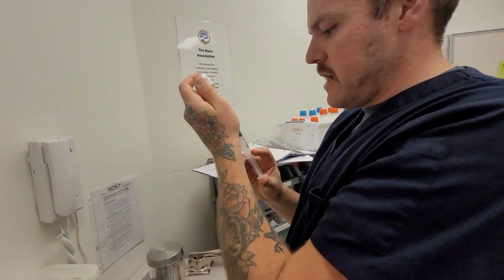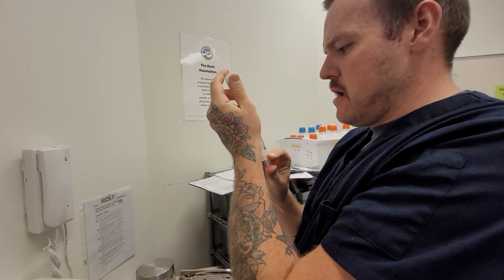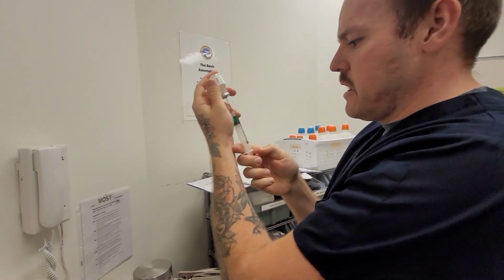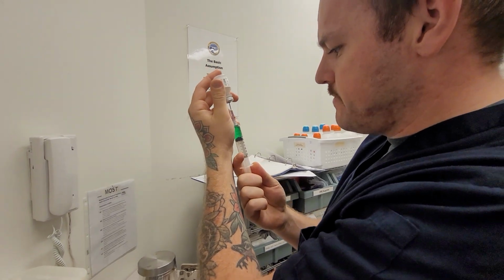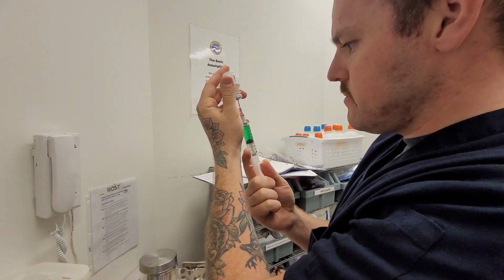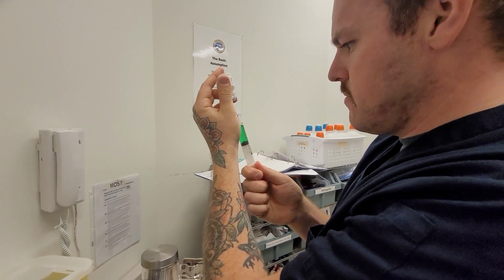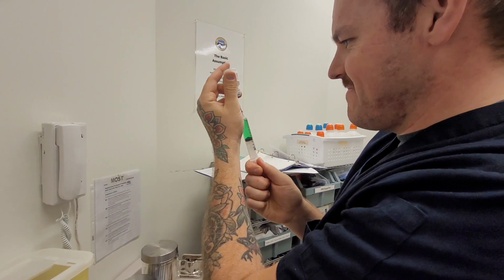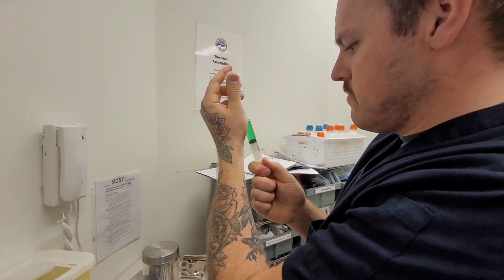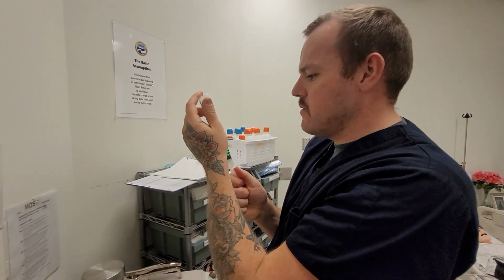Just as I suspected, we got a lot of air but no medication out, so put that in there. And we're going to be pulling this total syringe volume to 10. We're dealing with some air here, folks.